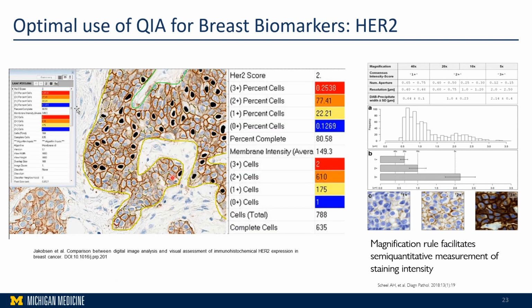So HER2 quantification is critical for deciding on anti-HER2 therapy. Quantifying HER2 is challenging for computers because it requires analysis of stain intensities, circumferential staining, and the percentage of positive invasive tumor cells. However, several tools are available nowadays to support HER2 quantification. These tools have been developed to enhance pathologist accuracy and efficiency, and include not only HER2 immunohistochemical stain methods, but other bright field applications such as HER2 chromogenic staining and dual-ISH staining.